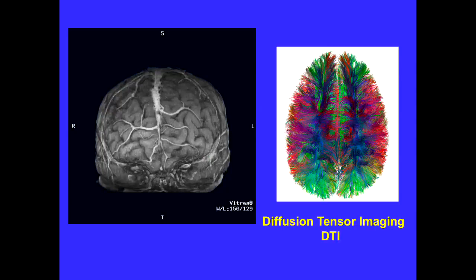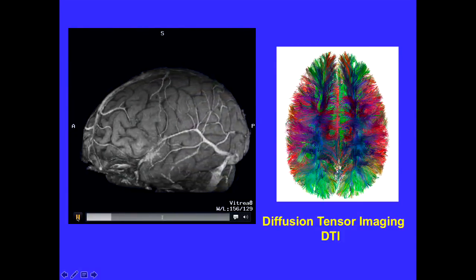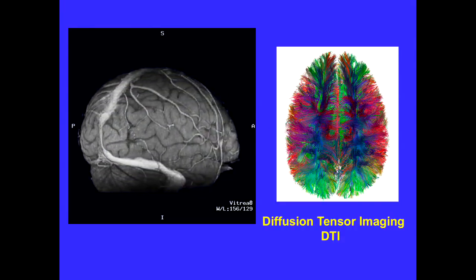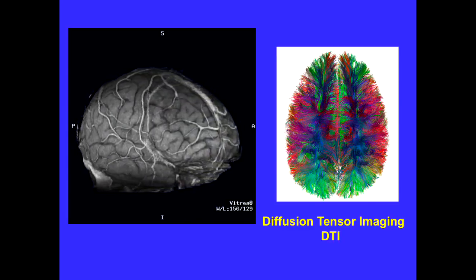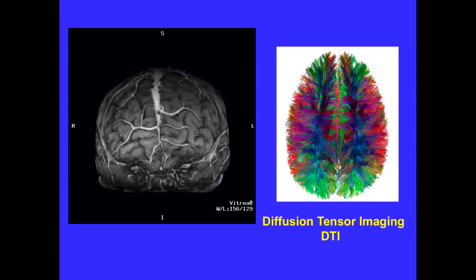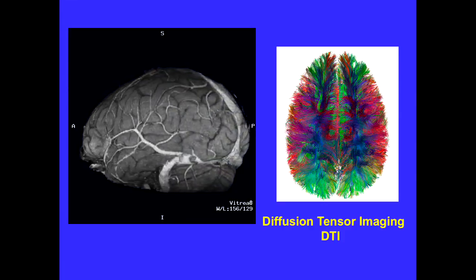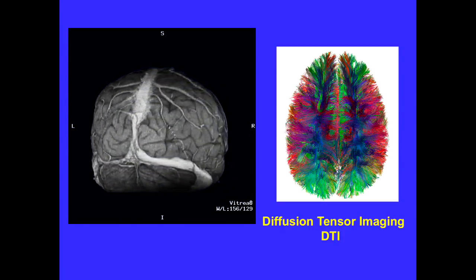We then moved on to MRI scanning. We talked about how the MRI scan requires a radio frequency pulse that flips a proton, and then the proton relaxes back. If it relaxes quickly, it doesn't measure water. If it relaxes slowly, 2.5 seconds, that's the relaxation time of water. We can use these different relaxation properties to get some index of where water is in the brain, and water, of course, accompanies many diseases. This one shows beautiful imaging of your venous structure. This is your venous draining structure.